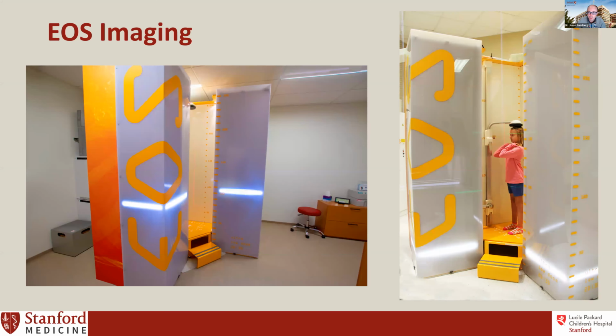And this is what one of these cool imaging systems looks like. It's a pretty large system. It's generally pretty colorful. They plop it into a room. They have a stepping stool to come in. The child gets positioned, and then it's a quick X-ray and you're done.